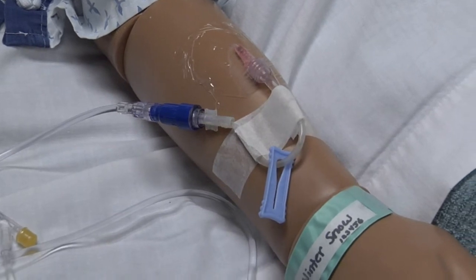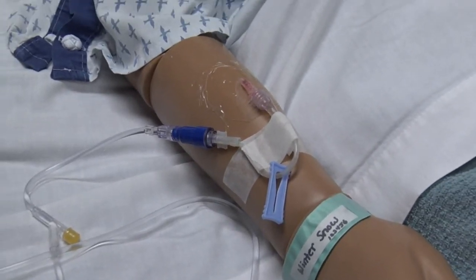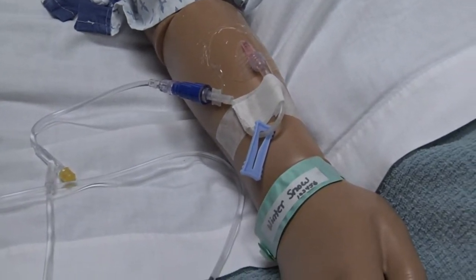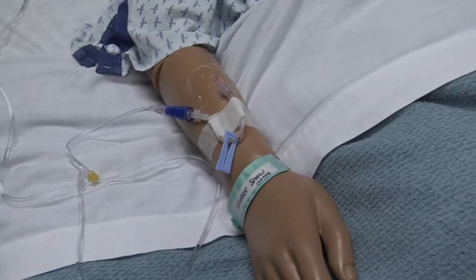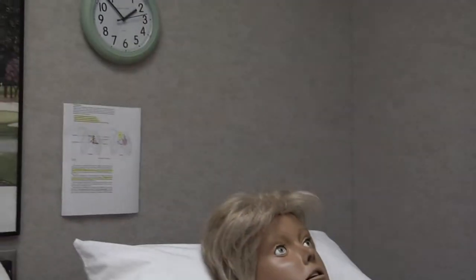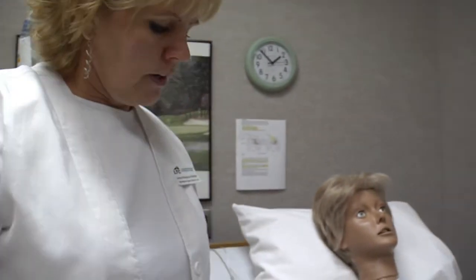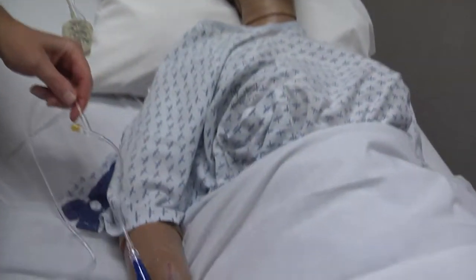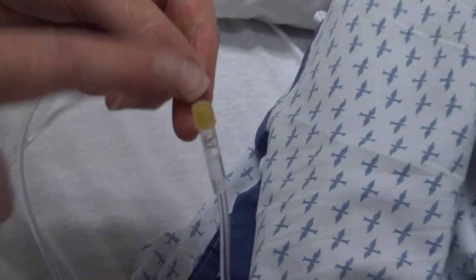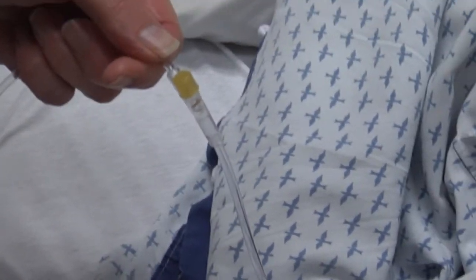The other problem is that the IV rate might not be running very well. It's just running kind of sluggish. So in that case, what I'm going to do is check to see if it is patent or not, or if it's occluded. So what we're going to do is take the IV itself and the nearest port. So this is the closest port to her IV site.